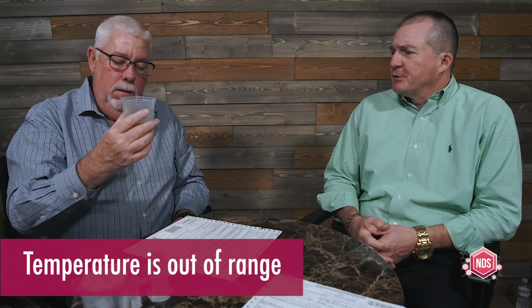We're back with our video blog series on the DOT urine specimen collection process. My donor, Tom, has just come out of the restroom and provided me his specimen. And we checked the restroom to make sure it didn't appear that anything had been tampered with. And I now have your specimen, Tom, and I'm noticing that the temperature is out of range. Okay, I'm not sure why that would be.